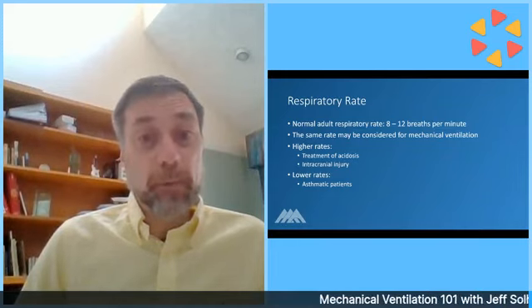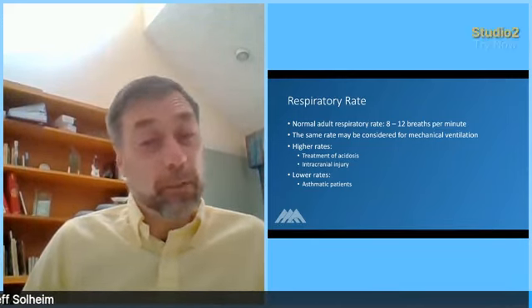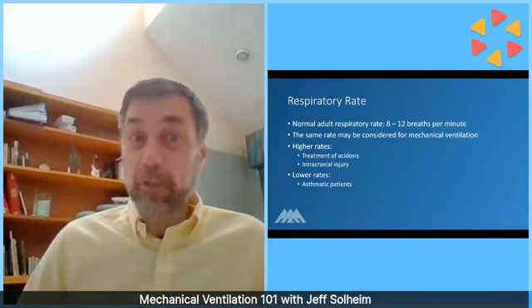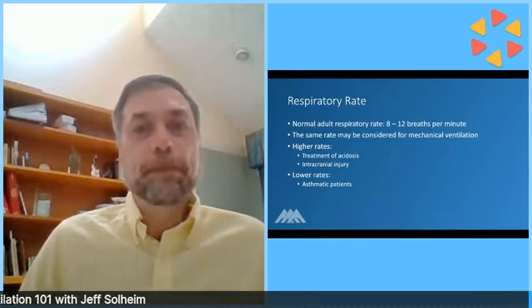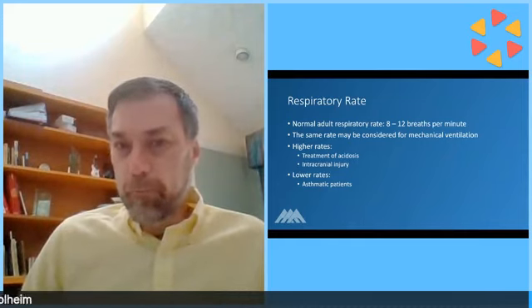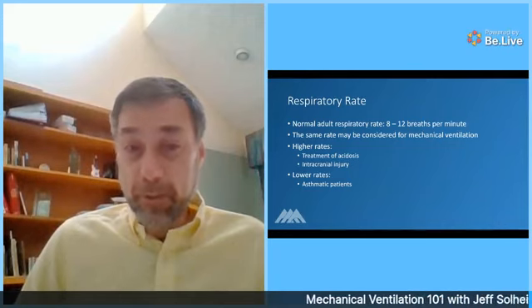And you're going to use higher respiratory rates for patients with acidosis, especially a respiratory acidosis, but you can use it to compensate on a metabolic acidosis. And we can use that for intracranial injury as well. And we may use lower rates for asthmatic patients who have narrowed airways. We want to make sure there's more time for them to exhale so we don't blow up their alveoli. Now, again, with your COVID patients, they are going to tend to have an acidosis.